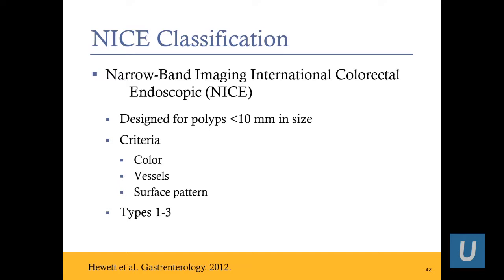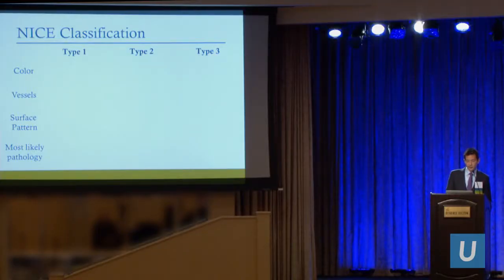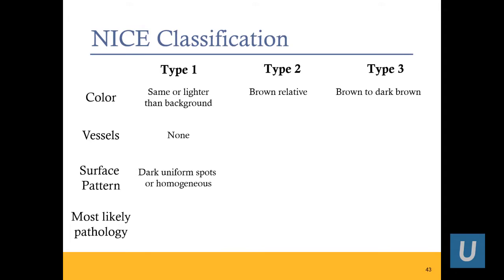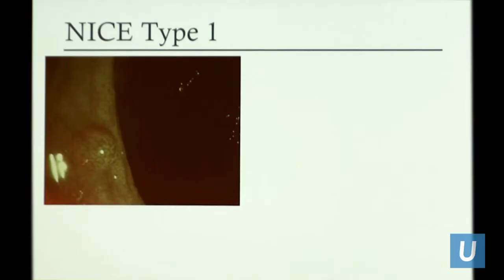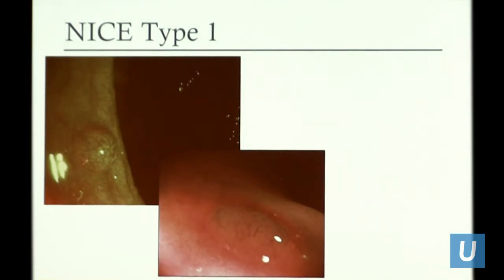The more clinically useful classification is the NICE classification — Narrow Band Imaging International Colorectal Endoscopic classification — designed for polyps less than 10 millimeters, based on color, vessels, and surface pattern. Type 1: the polyp has the same or lighter color than background, no visible vessels, dark uniform spots or homogeneous surface pattern — most likely a hyperplastic polyp. Sometimes you don't even need narrowband imaging for hyperplastic polyps, but this classification helps when you're in the rectum deciding: is this hyperplastic or an adenoma?